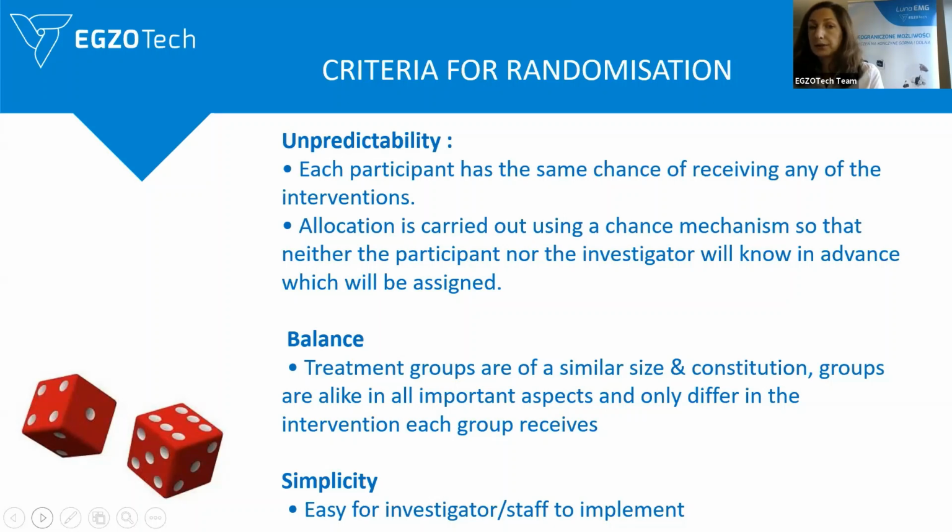And the last one is simplicity. So we need to make it simple and make it easy for the investigator, for the scientists, for the researchers who are involved in the study to implement.